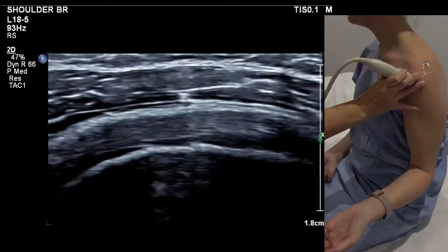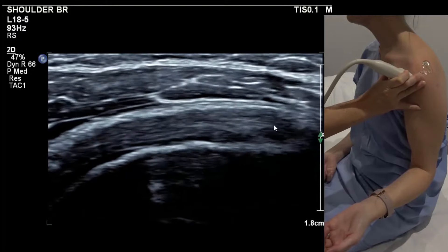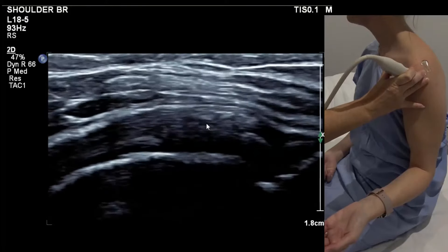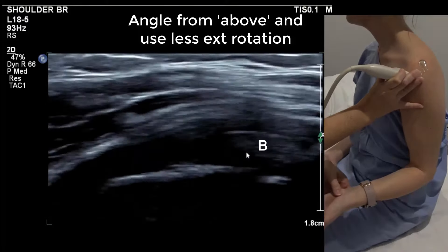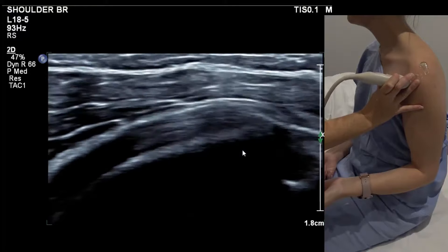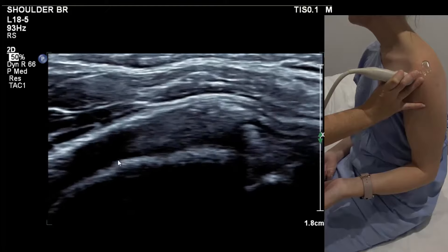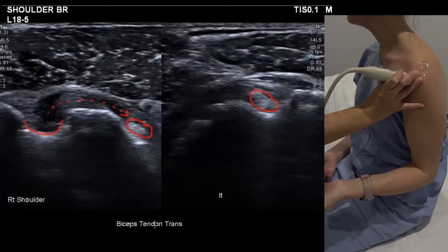It doesn't have to look like a perfect triangle because we're starting to see some of the fibres arching over the top of the long head of biceps. Less external rotation can be helpful — bring the arm back in. This is all subscap, upper fibres. If that's ruptured, the biceps will be allowed to sublux medially.